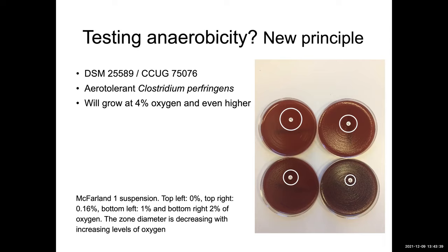However, as you can see, there's a disc on the plate, and that is metronidazole. And with increasing levels of oxygen, the metronidazole zone diameter will decrease. And that is actually a very, very sensitive method. And this method is just by using the standard methodology, EUCAST methodology for anaerobic bacteria with a McFarland 1 suspension on FAA and incubating for 16 to 20 hours.